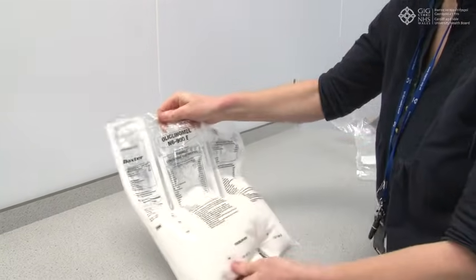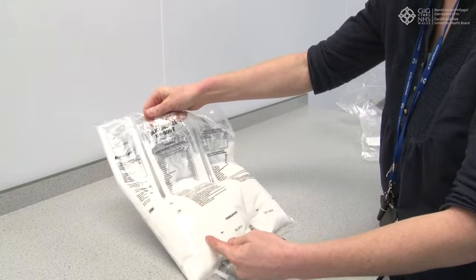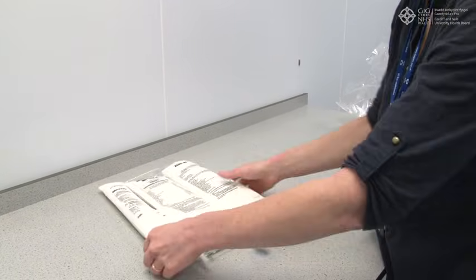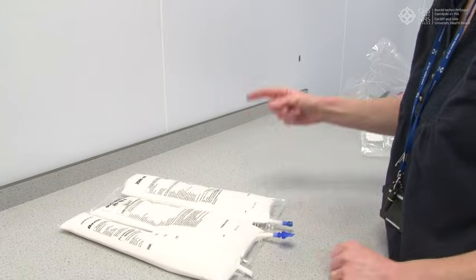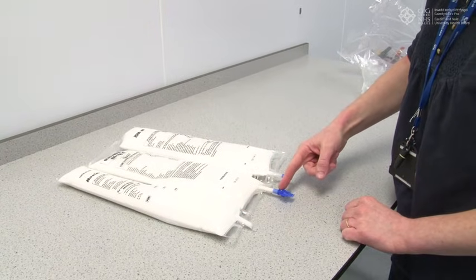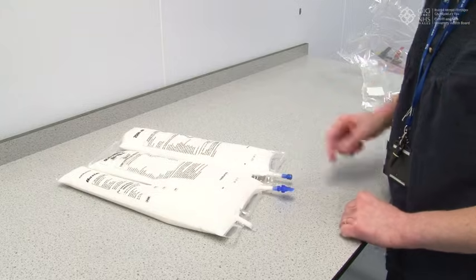You may then remove the outer wrapper. Hang the bag. Twist off the protector from the administration outlet and use as you would a normal home TPN infusion. Use this port for your administration set.